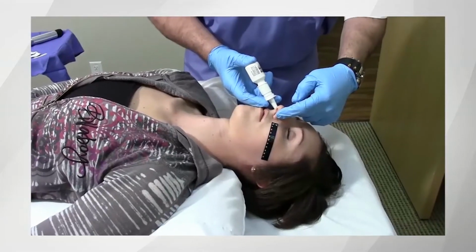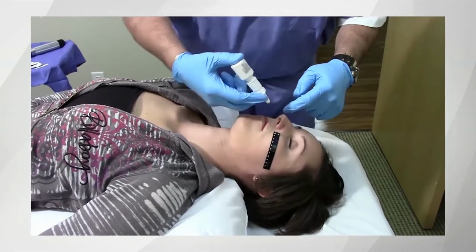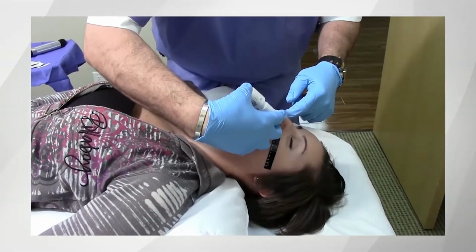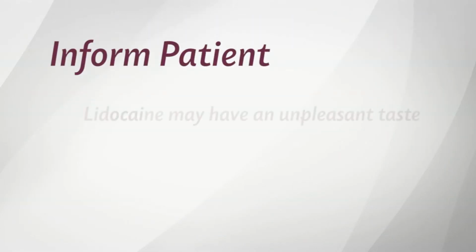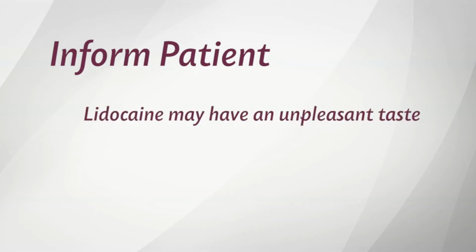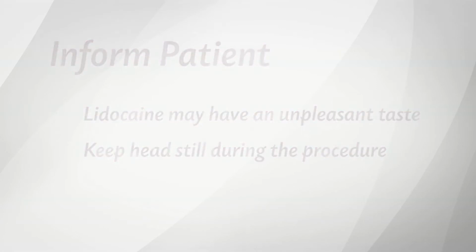If the practitioner elects to use either or both of the pre-procedure anesthetics, atomized or viscous lidocaine, this is the time to do so. Before beginning the procedure, inform the patient that the lidocaine may have an unpleasant taste. It is important to advise the patient that if they move their head or sit up during the procedure, it will negate the effectiveness of the procedure.